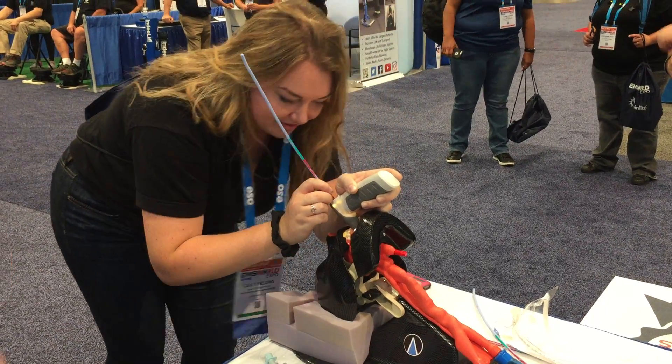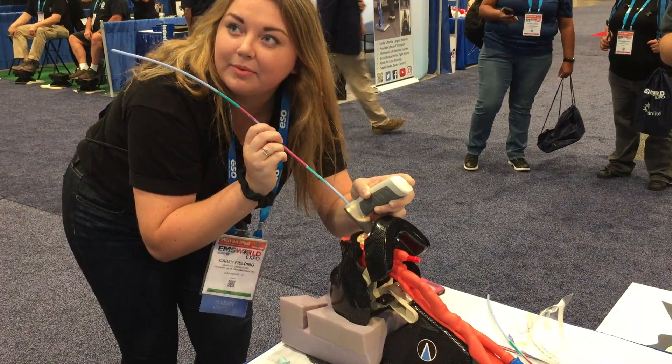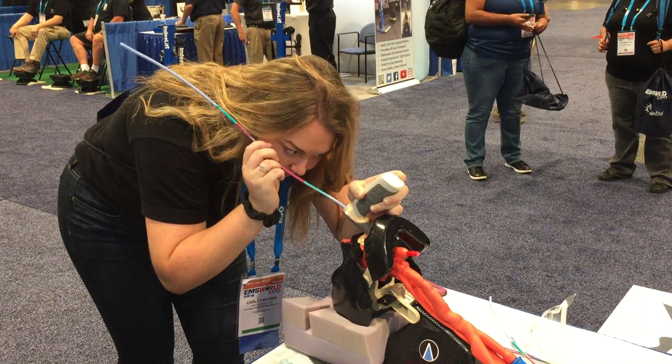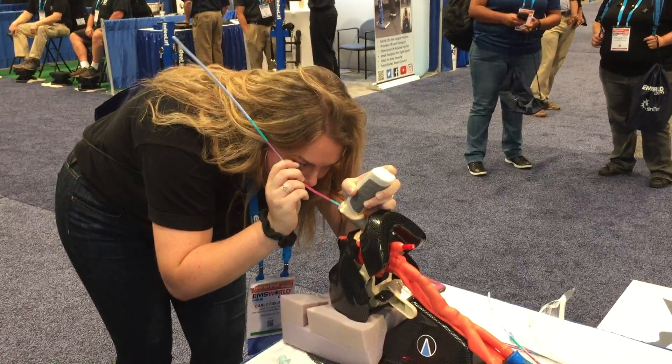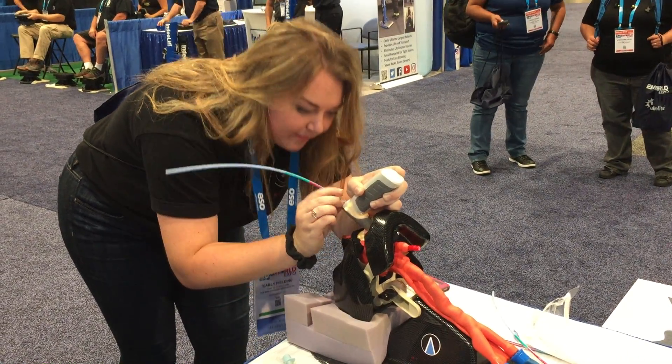We're on direct visualization. You should be knowing exactly where you're passing it. And it goes in the white part? Yep, put it in right between the white parts. There you go. Once it's in, take the scope out, but leave the blue thing in.